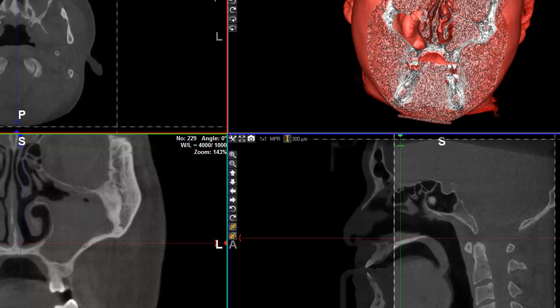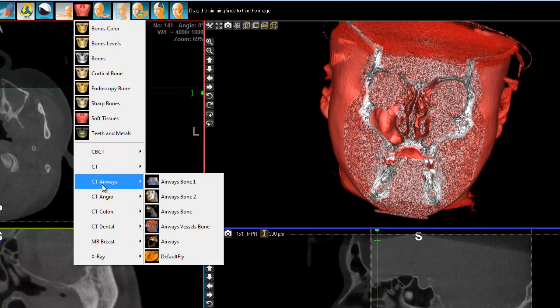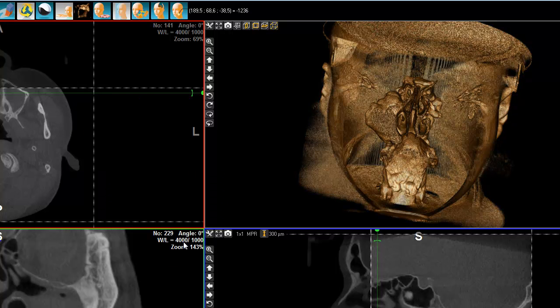What we're going to do is simply try to fill up this Sinus. For that, I need to define exactly the shape of this Sinus. I have a special mode, which is Airways, where I can select negative.